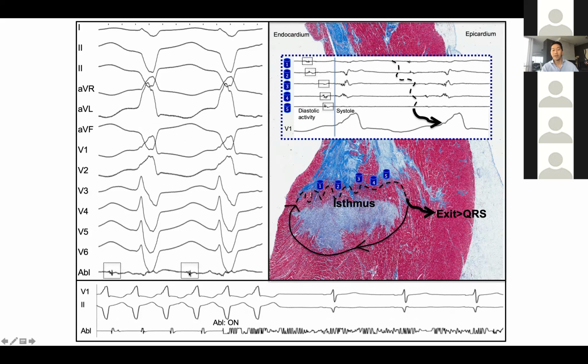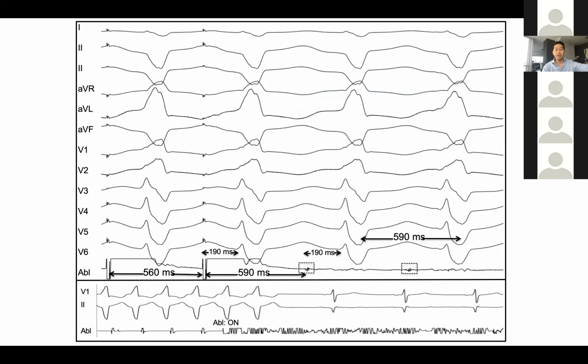We're looking for this. And when you find this, this happens quite easily. And this is like a pathway. It goes away that quickly if you can find that protected isthmus. These are the 3-point checklist. 1, here you go. QRS looks identical. Here's the last captured beat. Here's the VT. Identical, cut and paste job.